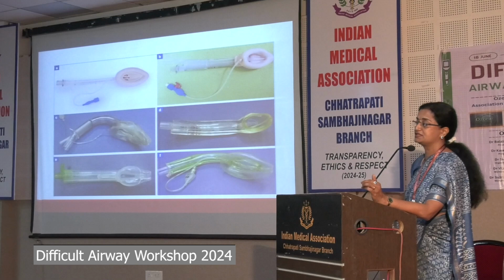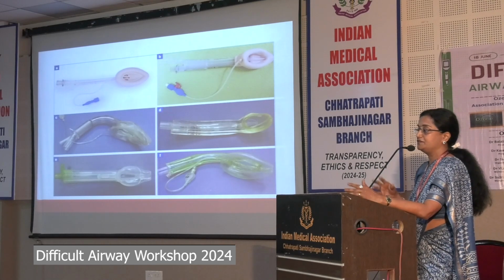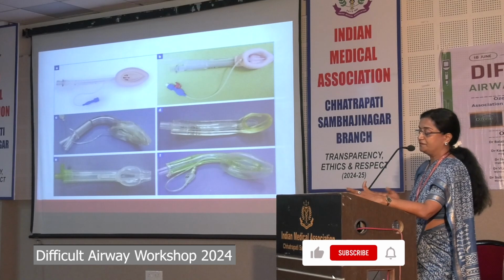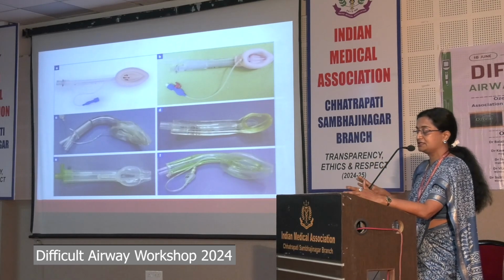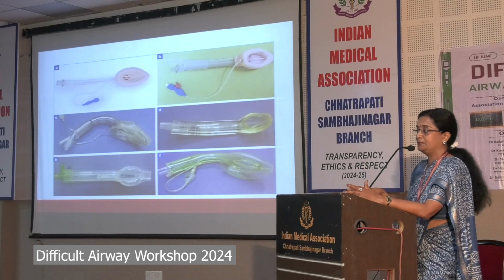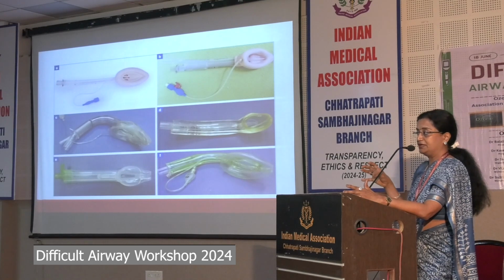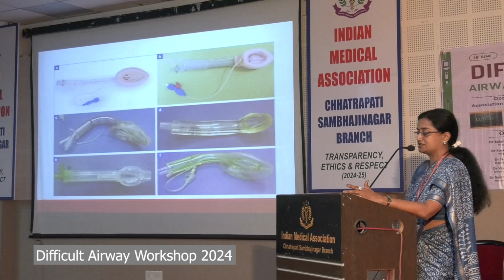The first generation is no longer in vogue. You prefer the second generation, but if you do not have a second generation and you land up in a cannot intubate situation, feel free to use the first generation also, because even if you cannot ventilate, it can give you enough time to call for help, call for an expert by giving apneic oxygenation. Only thing is you have to take care not to increase the airway pressures more than 20 centimeters of water.